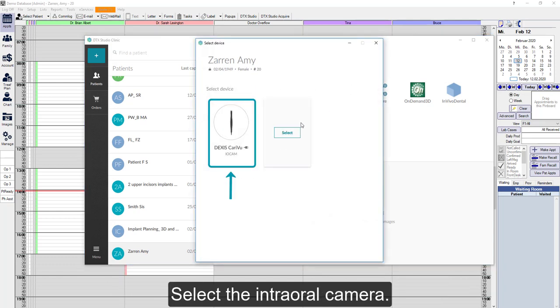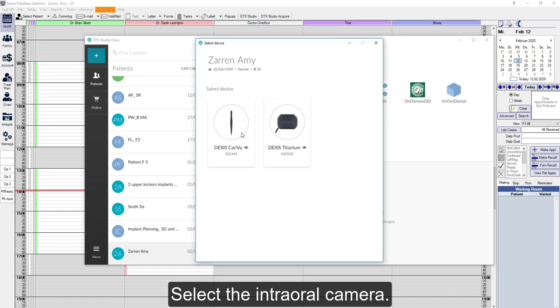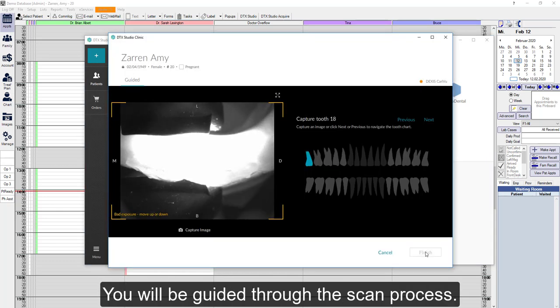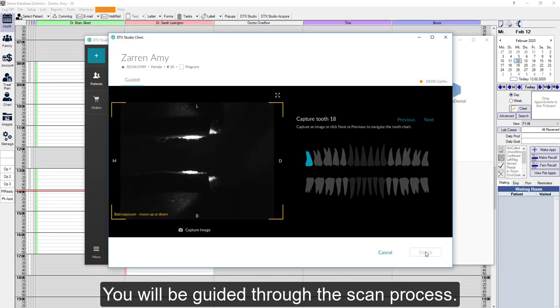Select the intraoral camera. The teeth you want to capture are selected. The software guides you through the scan process.